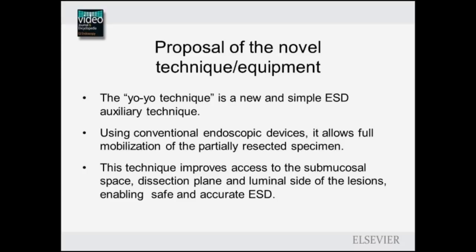The yo-yo technique is a new and simple ESD auxiliary technique. Using conventional endoscopic devices, it allows full mobilization of the partially resected specimen. This technique improves access to the submucosal space, dissection plane, and luminal side of the lesions, enabling safe and accurate ESD.